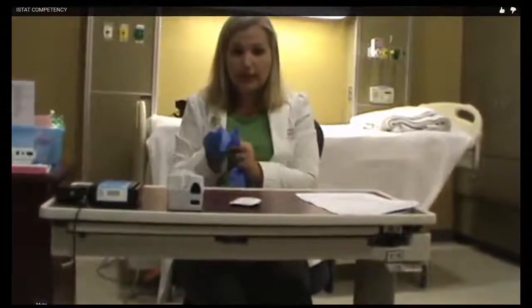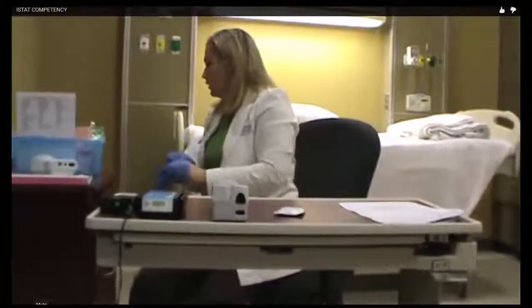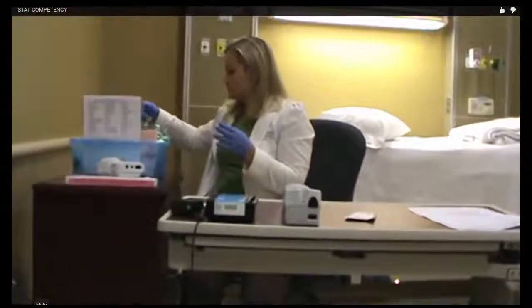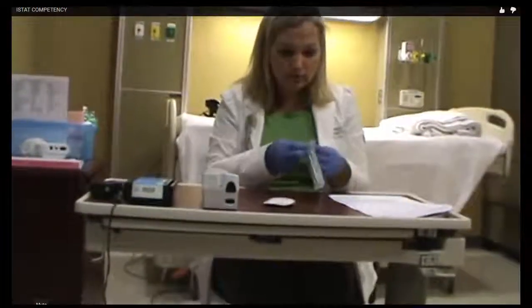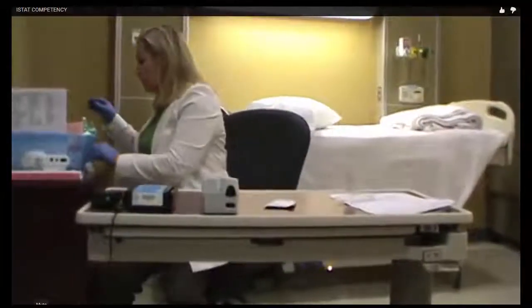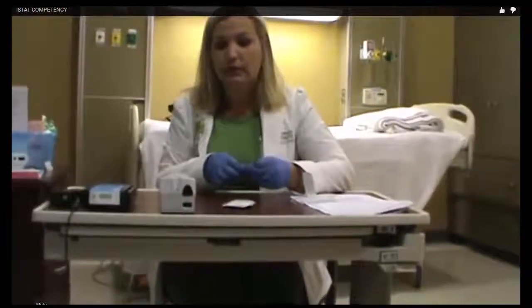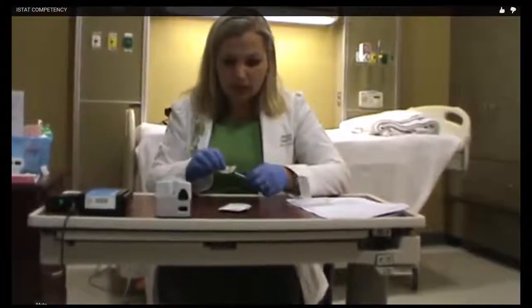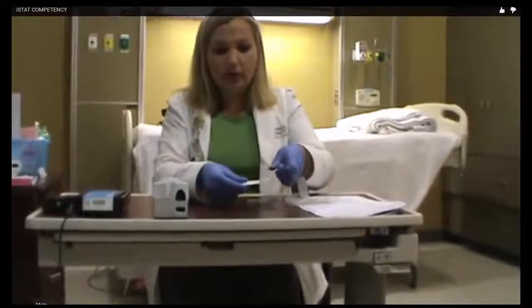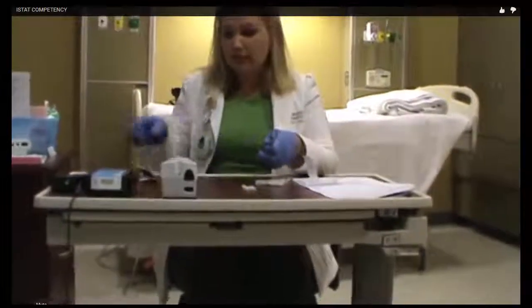Put your gloves on. Get your patient prepared with a tourniquet. Check your patient ID. Make sure you're getting the right person. But like I said, the most important part of this is to make sure that you have all your pieces prepared before you draw your patient. What will happen if you don't is that if you're using just a plain syringe, your specimen could clot off in the syringe before you are able to load it into your cartridge. So I'm opening my cartridge. You want to wait till you're ready to run. Open your cartridge. Okay, let me draw my patient.